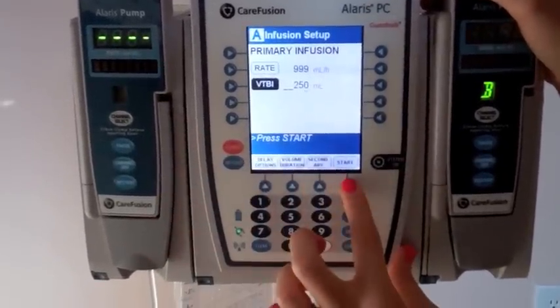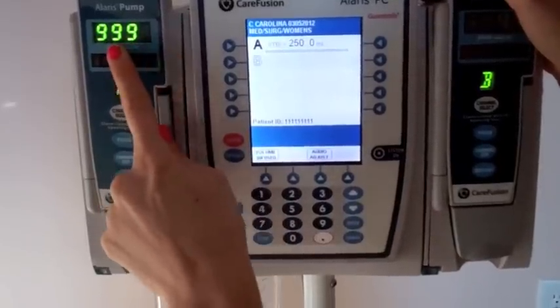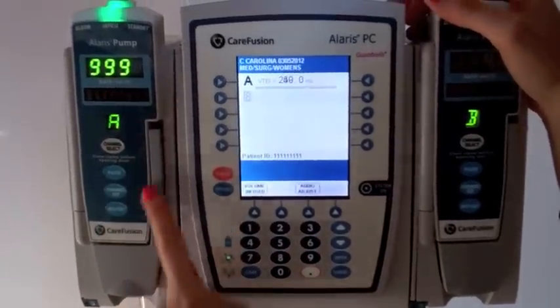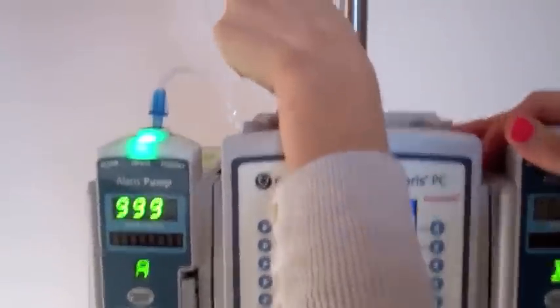For the basic infusion bolus, you would infuse as needed and just press start. You can see that we are giving a basic infusion and bolusing some fluid in. If you look at the tubing up here, it's going very fast — you can see the drops.